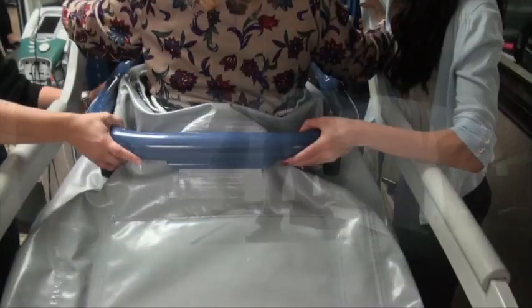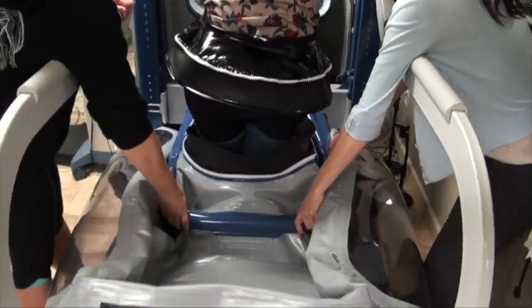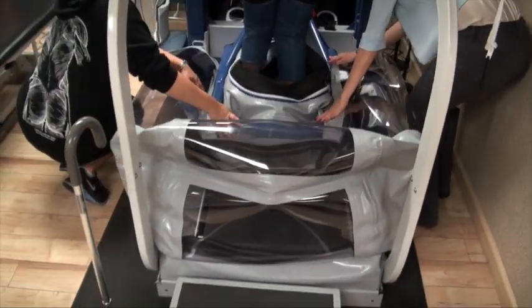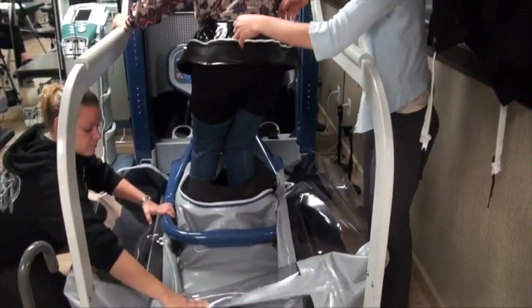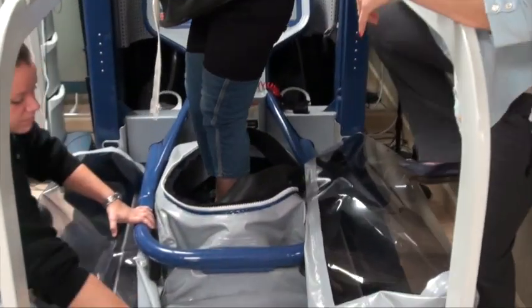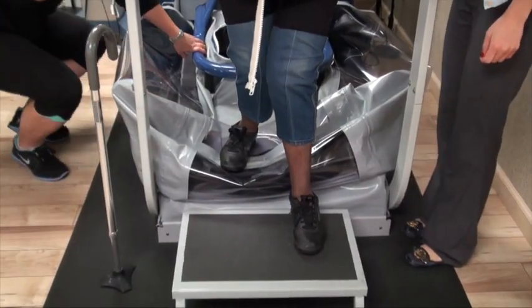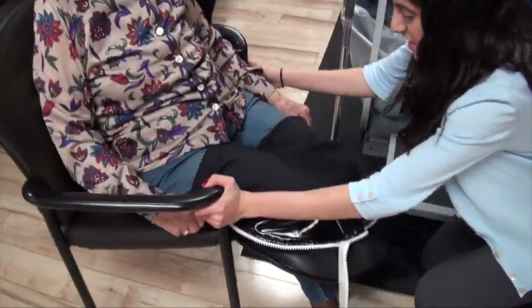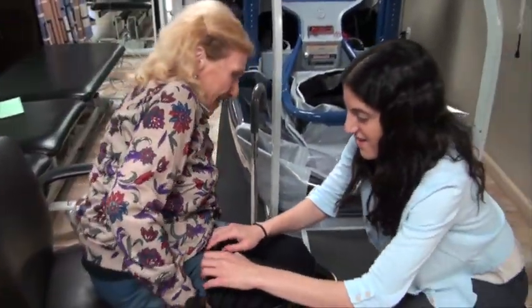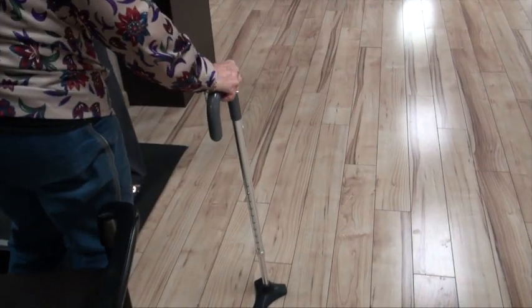The Alter-G can improve proprioception, increase muscle co-contraction and endurance, decrease muscle atrophy, and promote osteogenic stimulation while normalizing mechanics during gait. As of 2014, over 1,000 Alter-G anti-gravity treadmills are being regularly used in clinic, hospital, and university rehab settings.